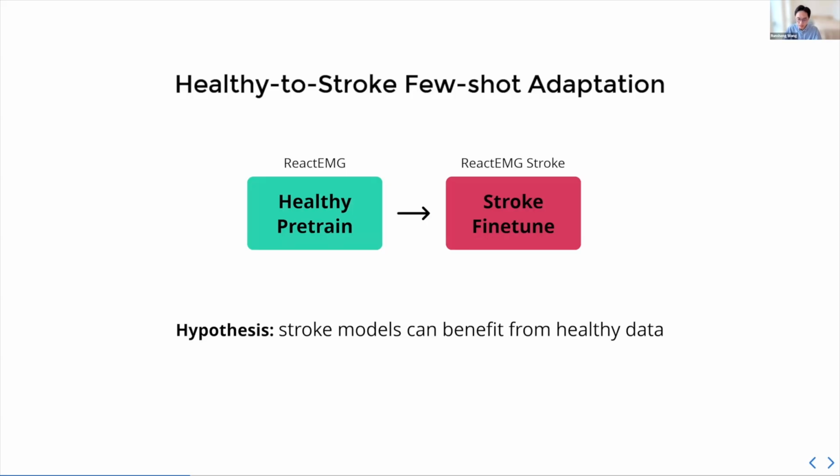This might make sense straight off the bat, but I'm sure OTs will disagree with me strongly because we all know that healthy and stroke EMG are very different. And as you will see very soon later in the talk, if you take a model trained only on healthy data and apply it directly to stroke, it does not work at all.